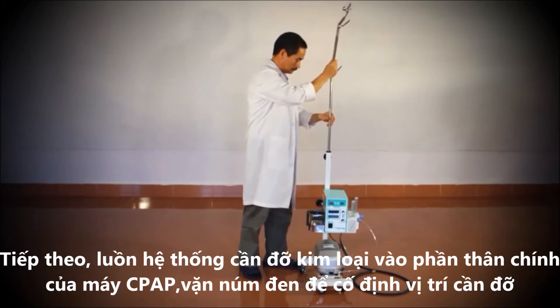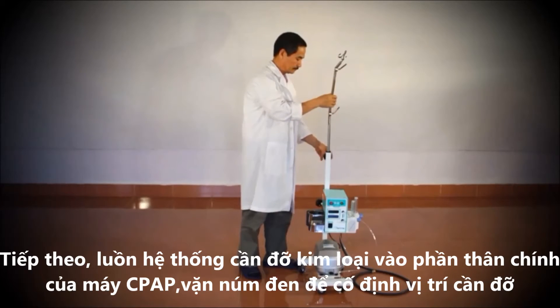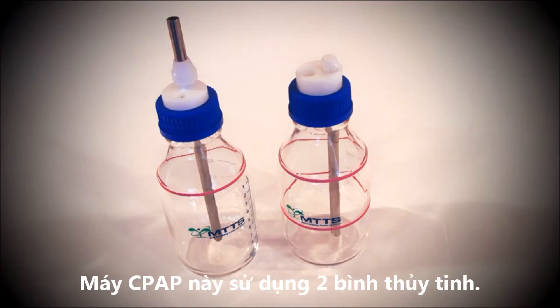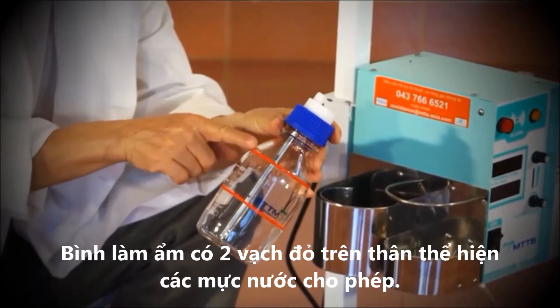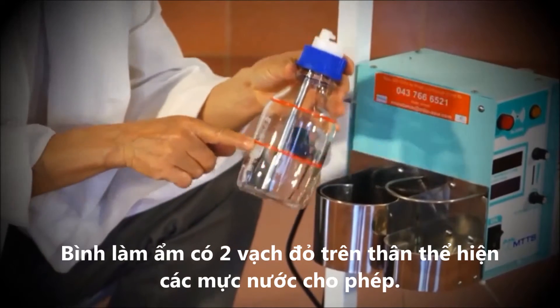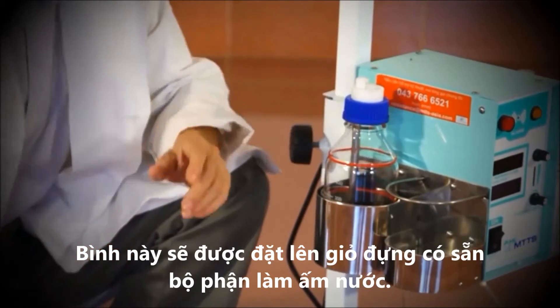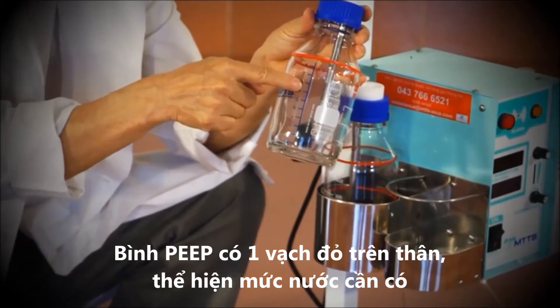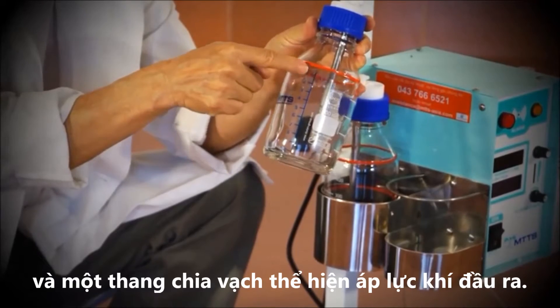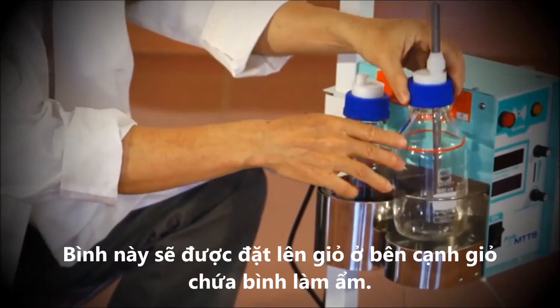Next, insert the CPAP arm into the main unit and secure it by tightening the black knob. There are two glass bottles used in this CPAP machine. The humidifier bottle has two red stripes indicating the range of allowed water levels, and is placed in the holder containing the heater. The PEEP bottle has one stripe indicating the required water level and a scale that indicates how much pressure the device is providing. This bottle is placed in the other holder.